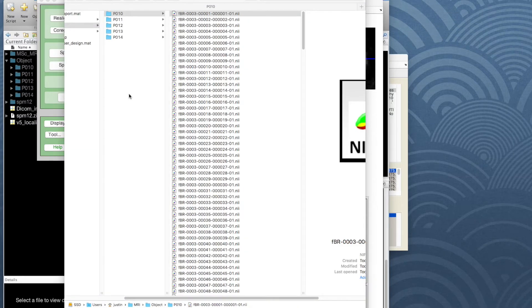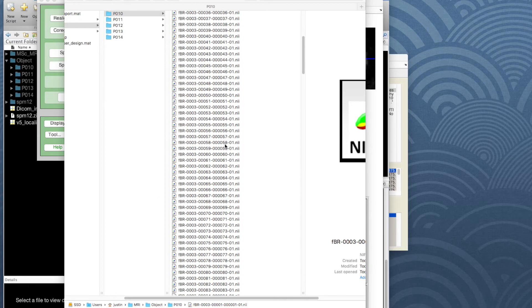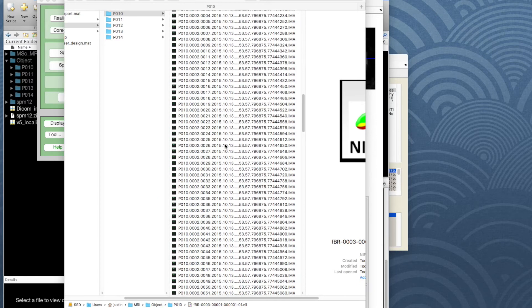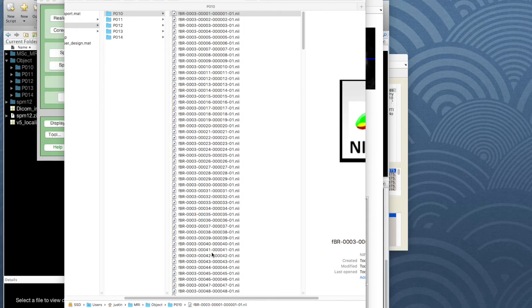We've converted the DICOM images and we're ready to start the analysis in SPM, but before we do that it's important to have a sensible folder structure for storing all our images. We're going to be producing a lot of new sets of images — already, just putting DICOM images and their NIfTI conversions in a folder, we've got nearly 400 images. We're going to have an awful lot more when we've finished, so we want to easily be able to select the images we want and make no mistakes.